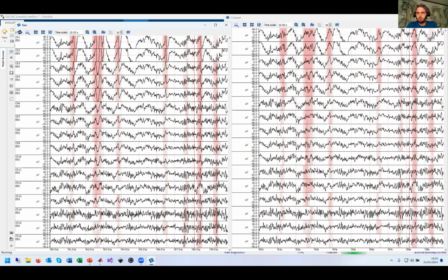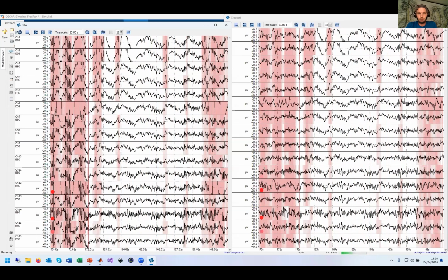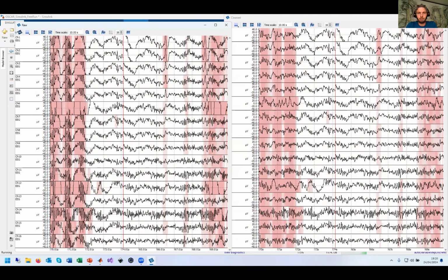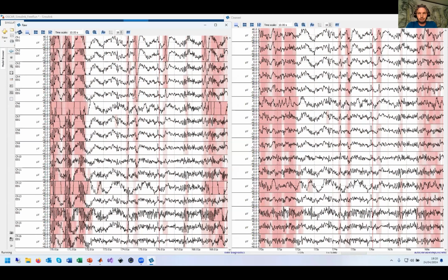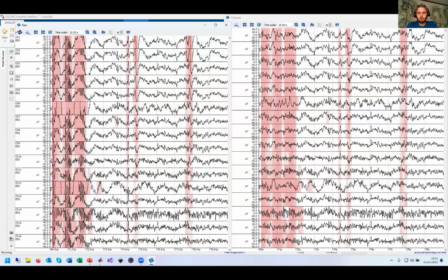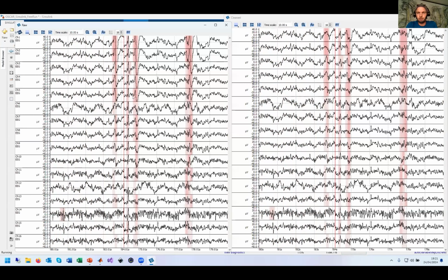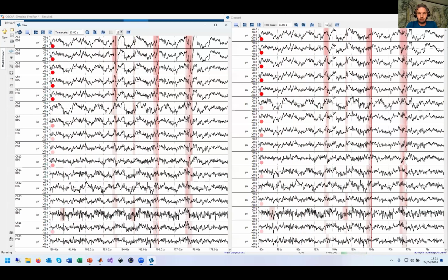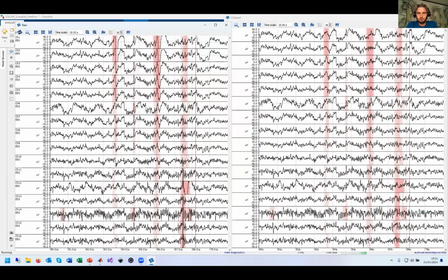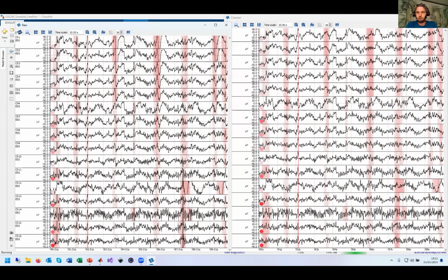So what else shall I do? Can shake the head. So all this is detected and corrected, and immediately afterwards, everything is going back to normal. And when the scope is white, the data is one-to-one the same. So you have exactly the original data. So it's not affecting the data when they're in absence of artifacts.